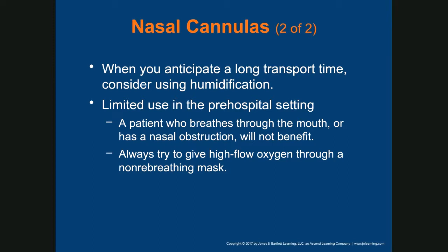Those patients require humidification. Now, outside of that, if you have a patient with any type of infection that is affecting their respiratory tract, or they have airway burns, you need to use the humidifier early for those patients, right?